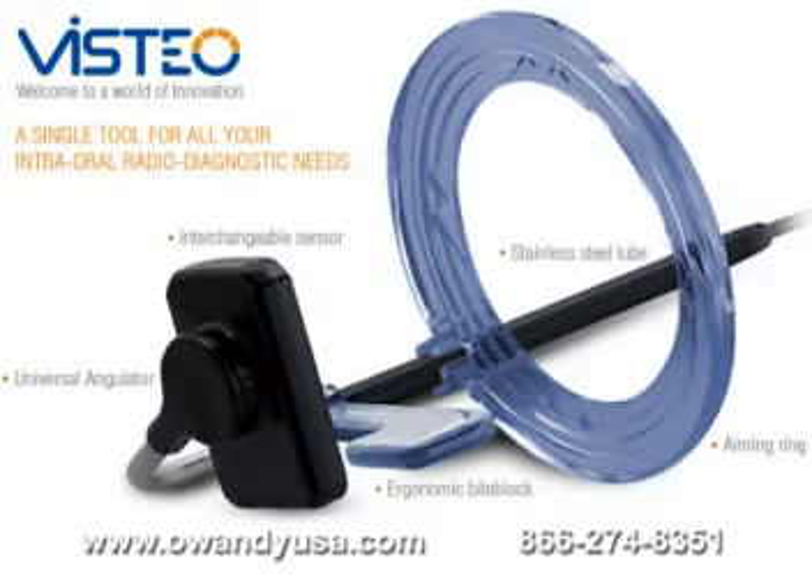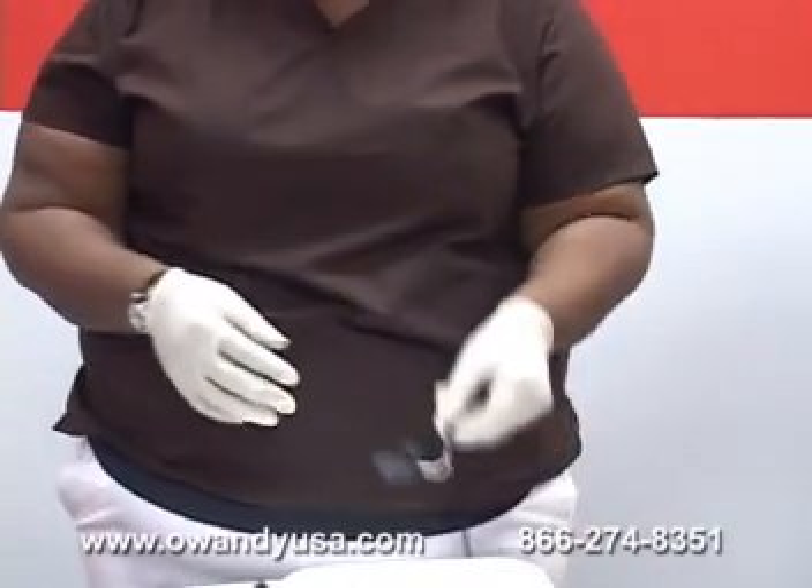Hello, my name is Chantel. I will be demonstrating how to take an FMX using the Visteo sensor, which is the only sensor that uses integrated positioning. Visteo has rounded edges for comfort.